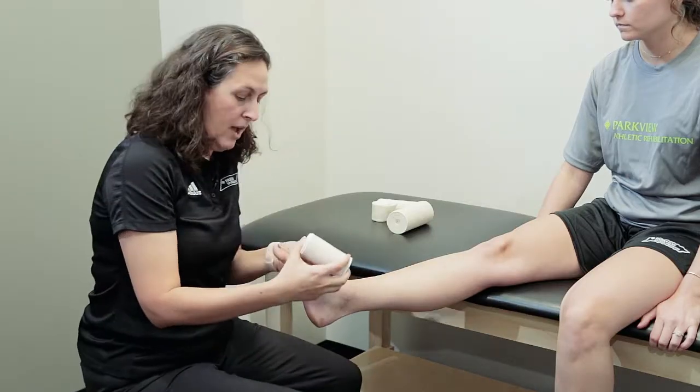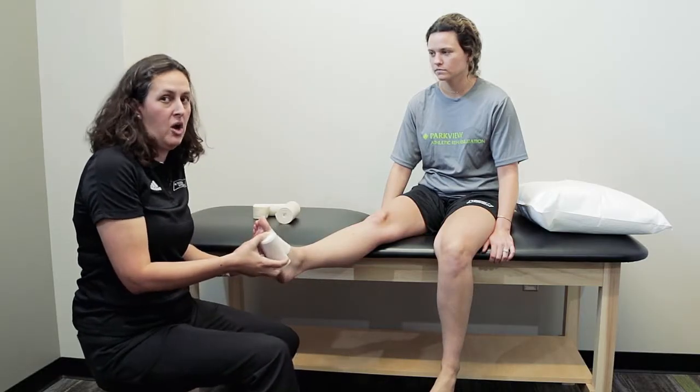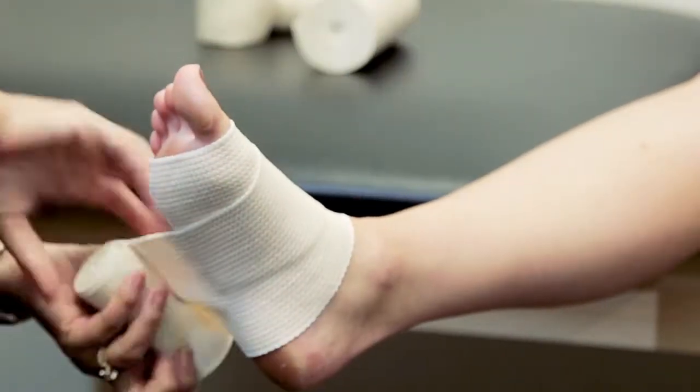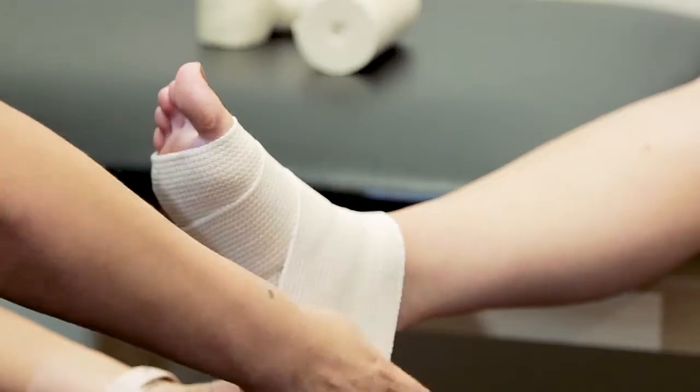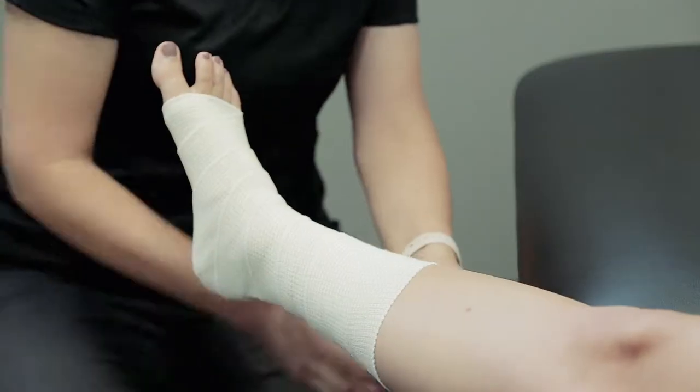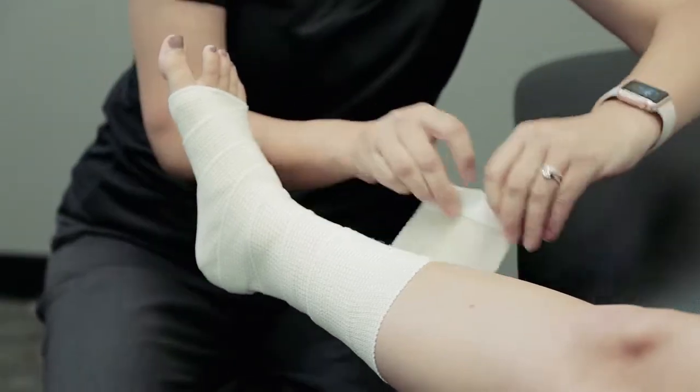When you start with your compression wrap, you're going to want to start as far away from the heart as you possibly can, but not include the toes or fingers. As you begin wrapping, you'll want to overlap your compression wrap by about half and make sure there's no skin showing in between the wrap. You'll continue up the body part until you run out of compression wrap.